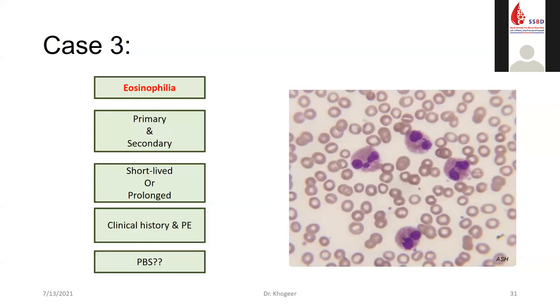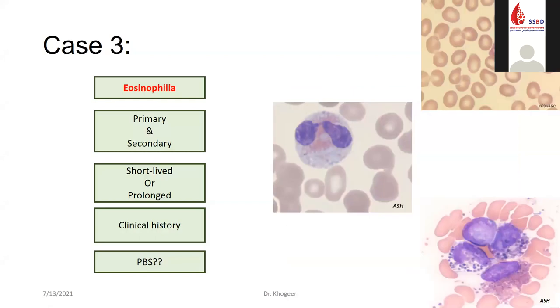Peripheral blood smear has limited utility to distinguish between reactive and neoplastic causes of eosinophilia. However, some mild dysplastic features, including hypogranularity, hypersegmentation with more than three lobes, and vacuolated cytoplasm, can also be seen in reactive conditions in a limited fashion. However, frequent or marked dysplasia, especially when you have eosinophils with abnormal coarse granules like this one, coupled with dysplasia in the other cell lines or coupled with blasts, favors a neoplastic process.